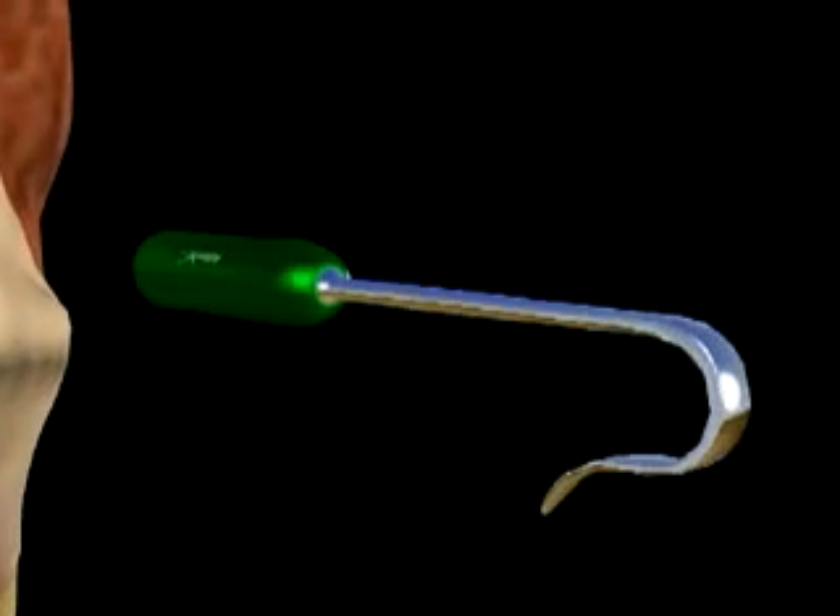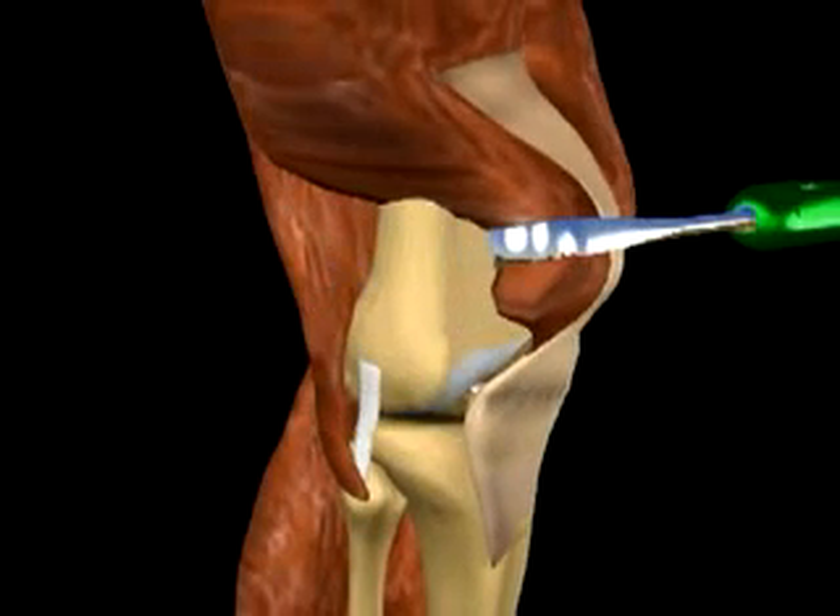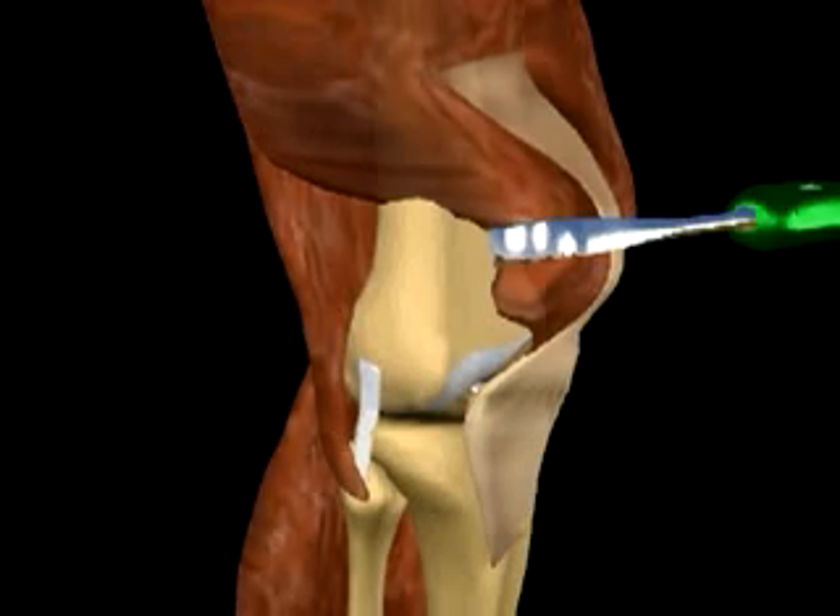The Arthrex Quadriceps Tendon Retractor is used to protect the vastus lateralis and thigh musculature throughout the procedure. An additional retractor is placed posterior to the femur to protect the neurovascular supply.